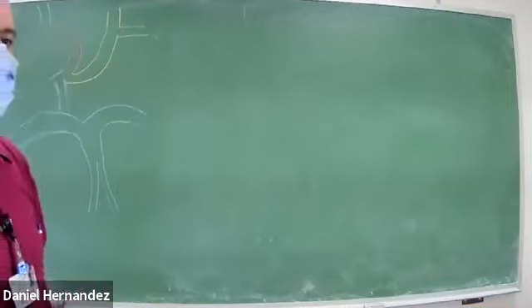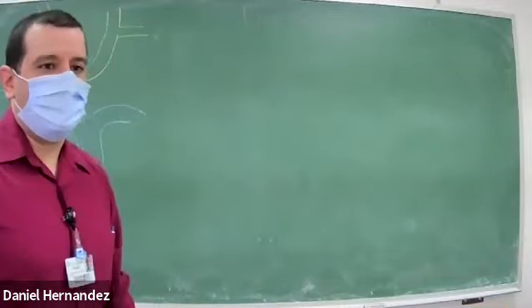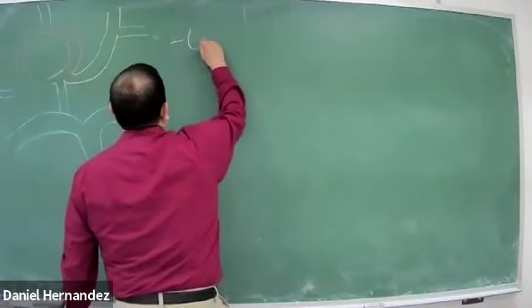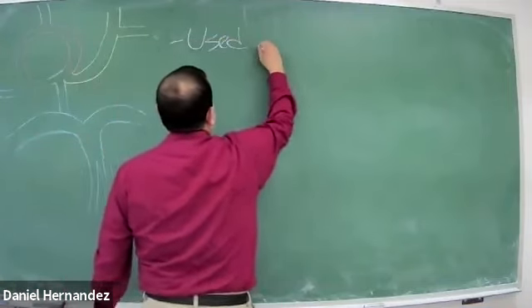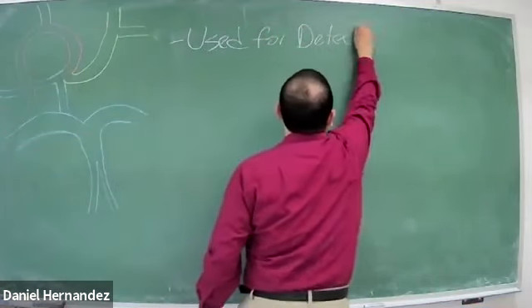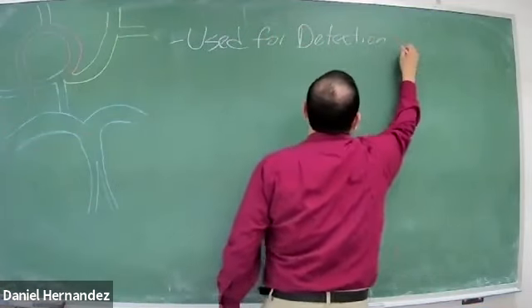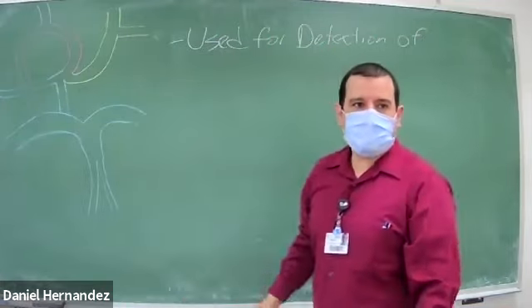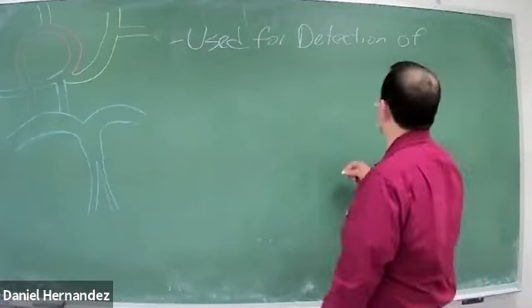So why are we doing transcranial Dopplers? It's used for detection of intracranial stenosis and occlusion.